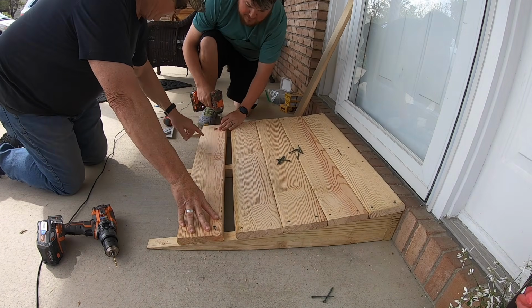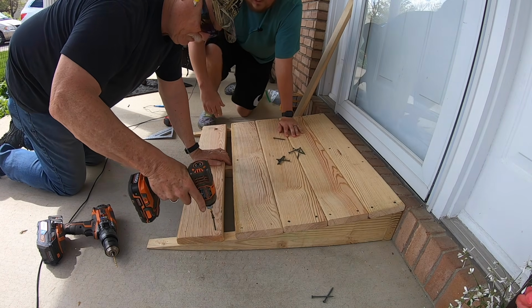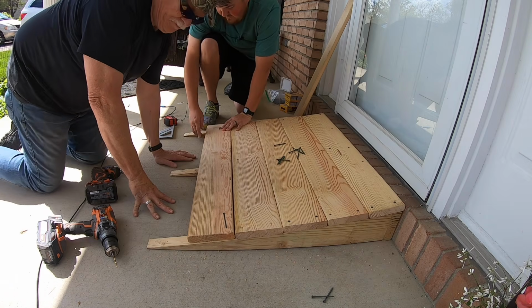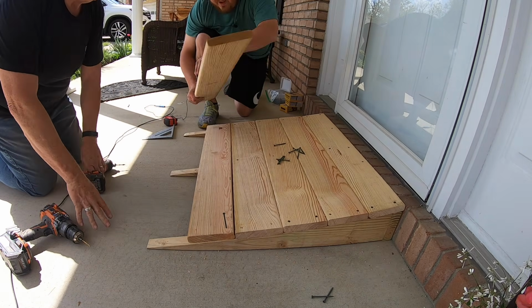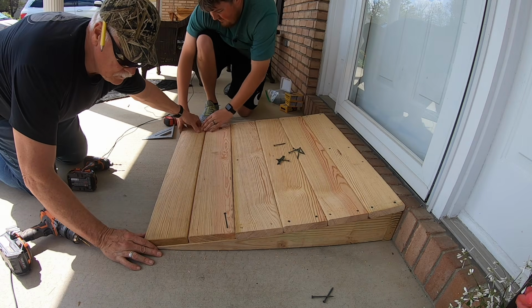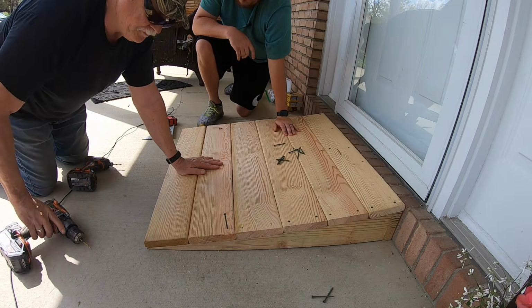And then when you get down here, you are going to go ahead and remove these on both sides, because obviously we're not going to cut a board for that, but we're just going to go ahead and scoot that up. And let's pre-fit. And we're going to go ahead and kind of test the last board as well to see where we're at. Make sure we're all fit and snug and right where we want to be.